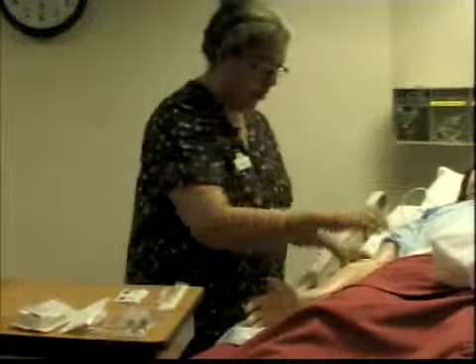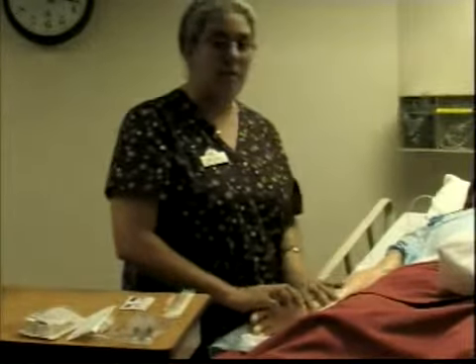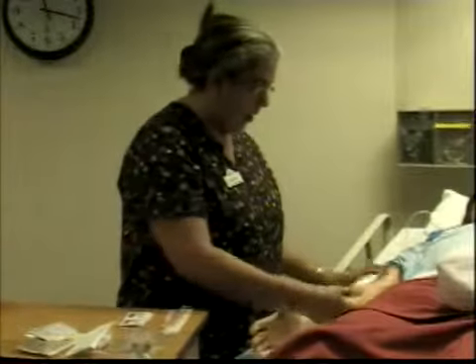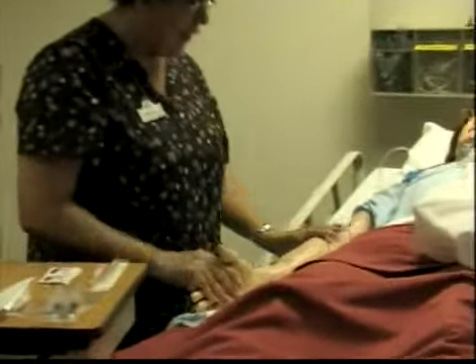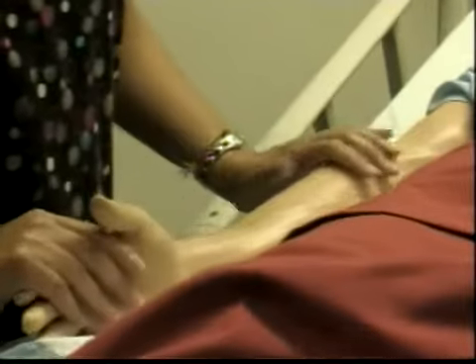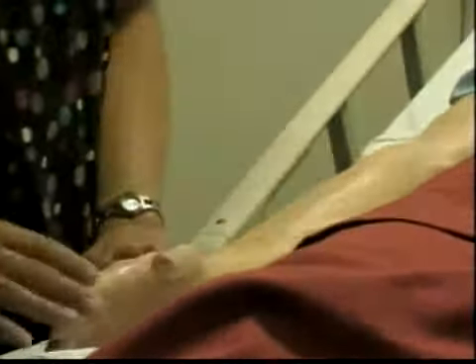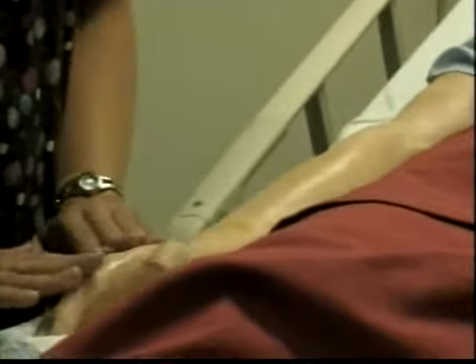I already have checked all that medical history from before. I have looked and made sure that I'm using an extremity that is able to do so. So the first thing I'm going to do is look at my extremity. I'm going to look for any bruising, any scars, any swelling or anything like that that will prevent me from performing a needle stick.